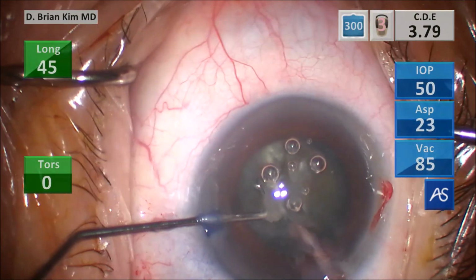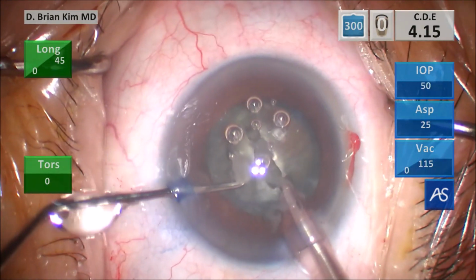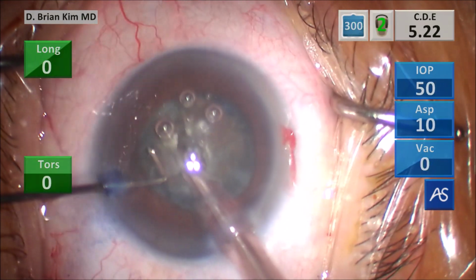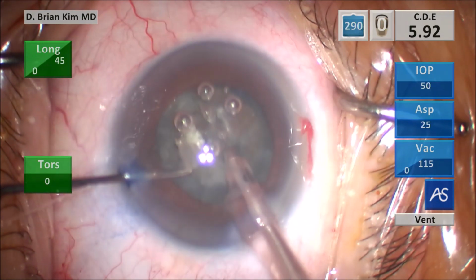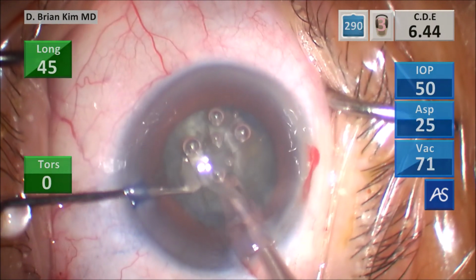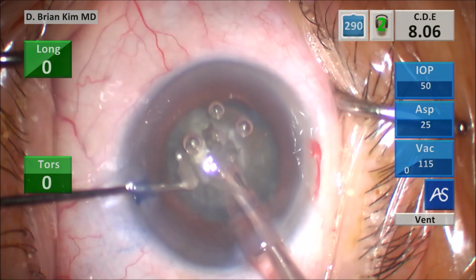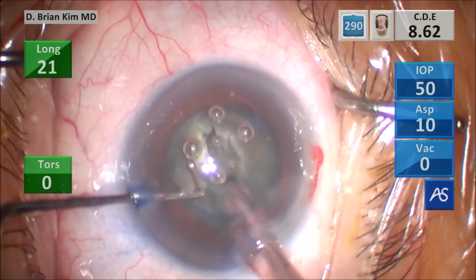So I go ahead and remove the surface epinuclear material. Because this is a dense lens, I'm in dense mode. I'm sculpting a central trough. Again, you don't want a very big trough. You don't need a very long trough. I'm just going from one rhexis edge to the other, about 6 millimeters.